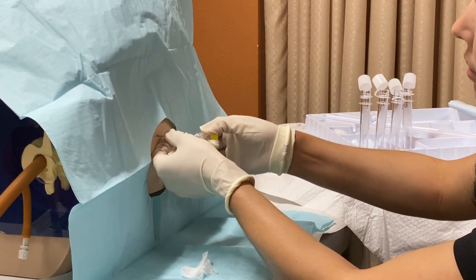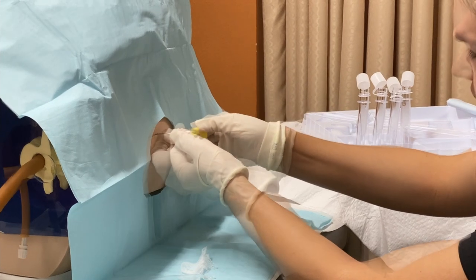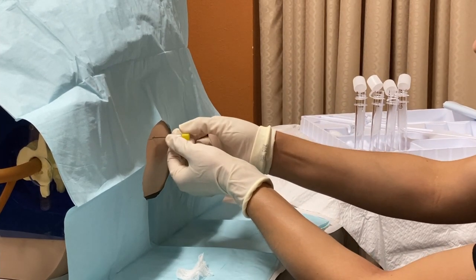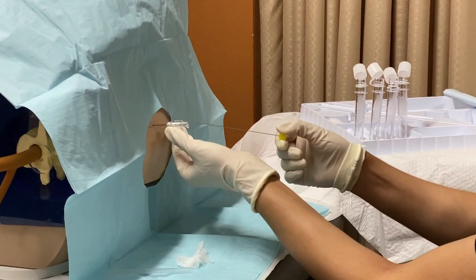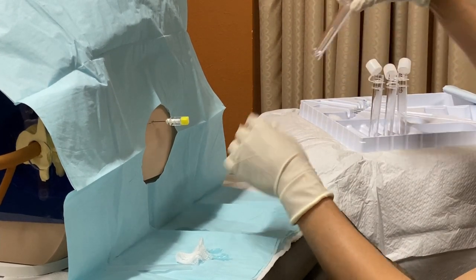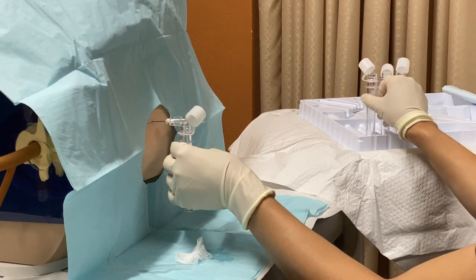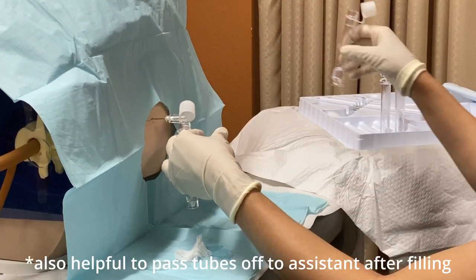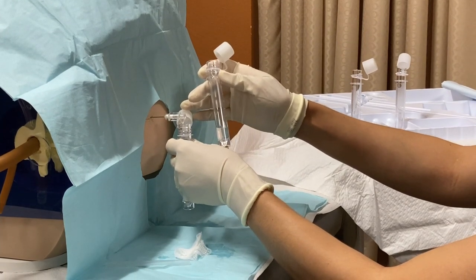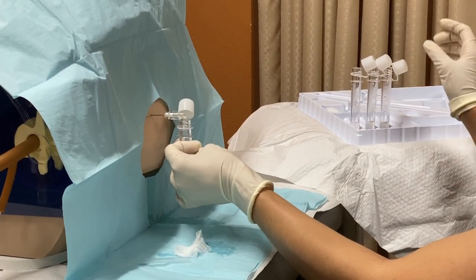You're inserting — passing epidermis, dermis, subcutaneous tissue, supraspinous ligament, interspinous ligament — and you're going to feel that pop for the ligamentum flavum. Once you feel that pop, there's your CSF. At that point, you can either use your thumb to stop the flow or place your stylet back. Have your first tube ready. Collect your first tube, second tube — collect the correct amount for each, and remember to collect in the right order.